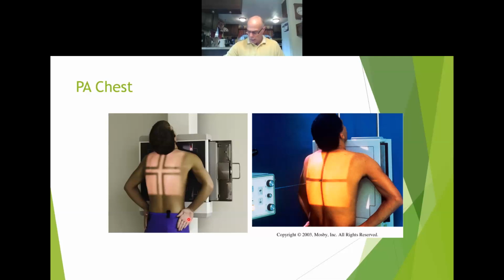Okay, turning over to page 107, we're going to talk a little bit about the actual procedure itself. PA projection on your image receptor plus a grid. It says that the CR plate is usually 14 by 17, lengthwise or crosswise. That is a CR plate. Remember, you will be going into a DR world where there are no longer plates that you will physically go get. So the dimension you'll probably be working with is the fixed 17 by 17. So you don't have that to really worry about when you're doing the chest x-ray.